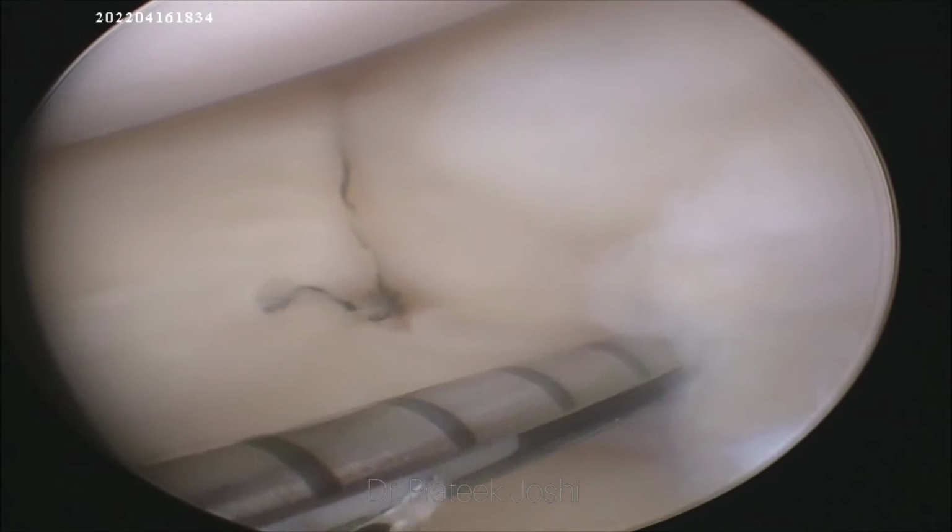We are going to follow the same steps to take another vertical mattress knot.